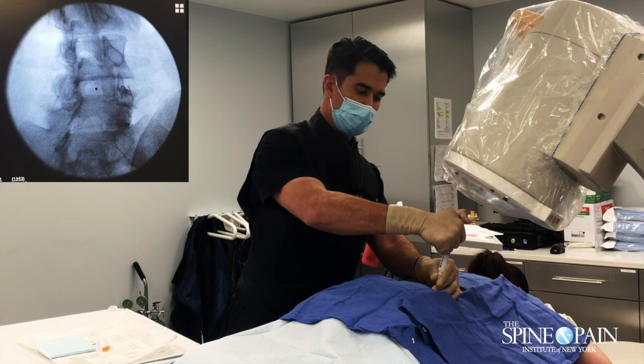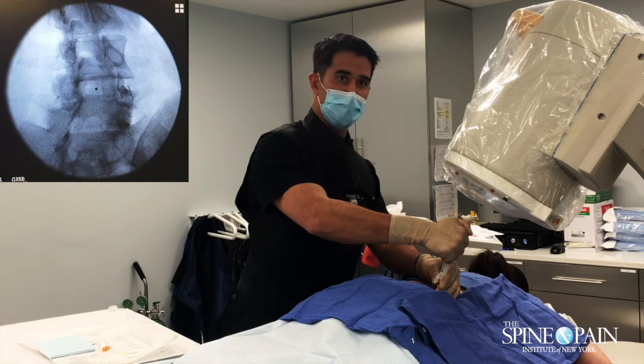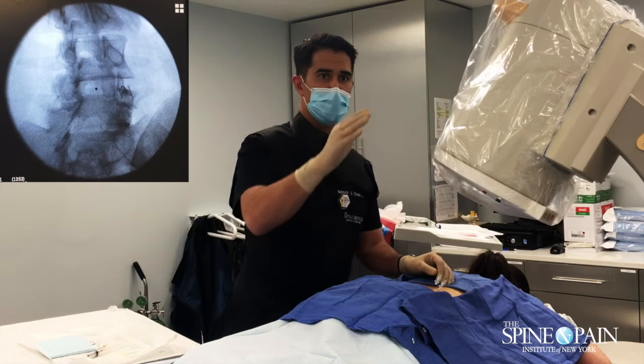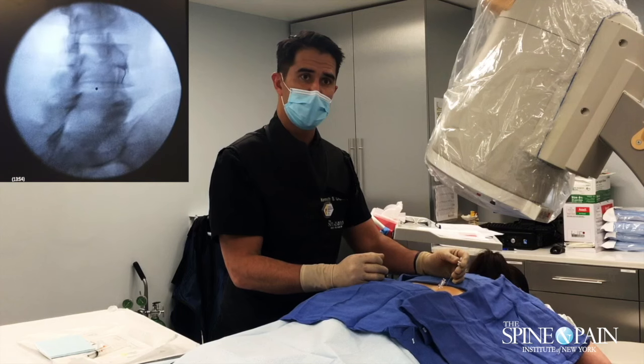Putting in a combination of Kenalog and Marcaine — a little bit less than a cc per level. There's the L4 nerve root and the L5 nerve root; the little branches come off and we just block those there.